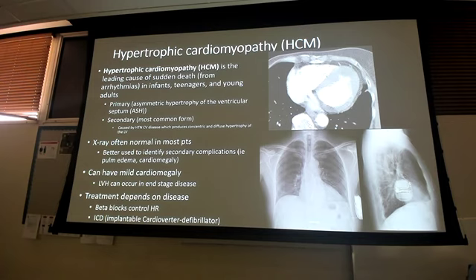The only difference between a left and a right lateral chest x-ray, guys, the only reason it's a left lateral is to decrease the magnification of the heart, right? That's the only reason. There are no anatomy changes, no view changes, outside of the fact that the heart might be magnified if we do a right lateral instead of a left lateral, because the lungs are superimposed on one another. So you're not going to see anything different regardless of this way versus this way, except that the heart might be more magnified.